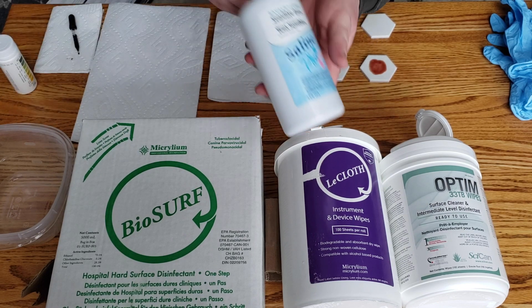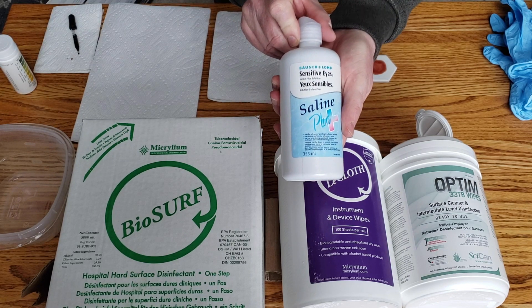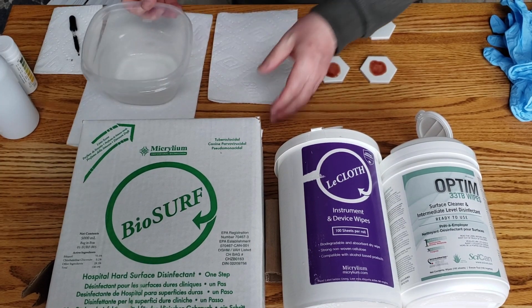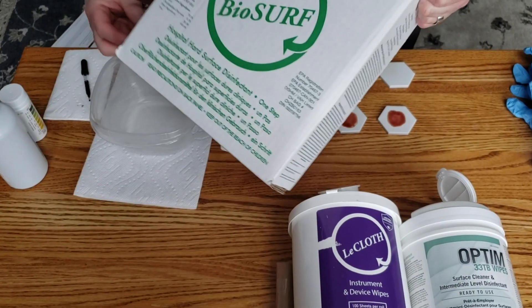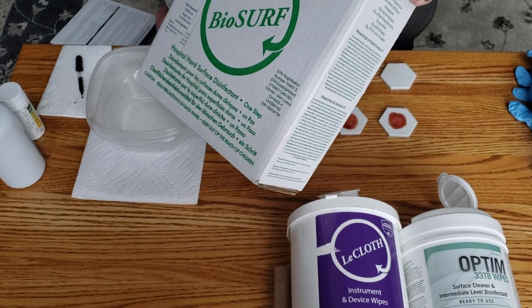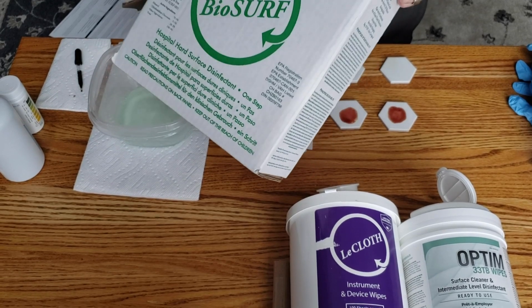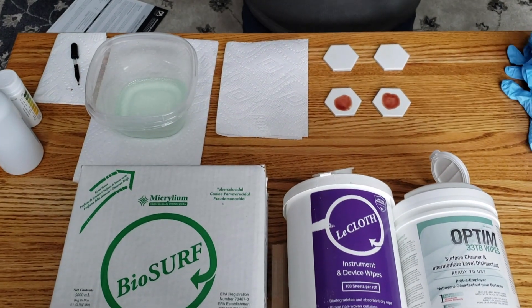I'll be activating the sticks using sterile saline. We'll take some of the BioSurf, pour it into a container, and we're ready to go.